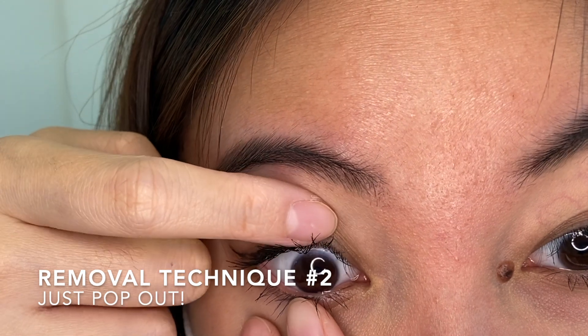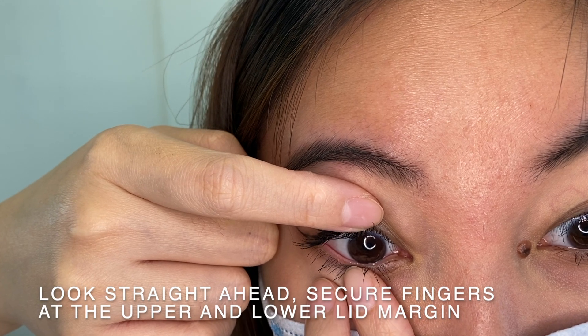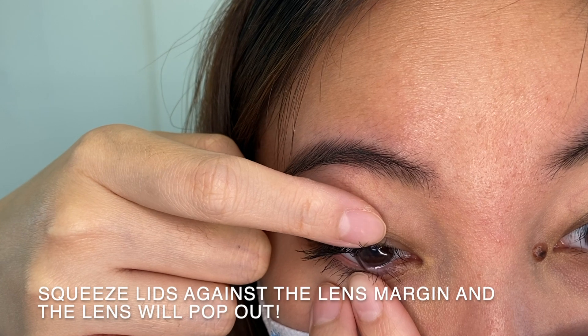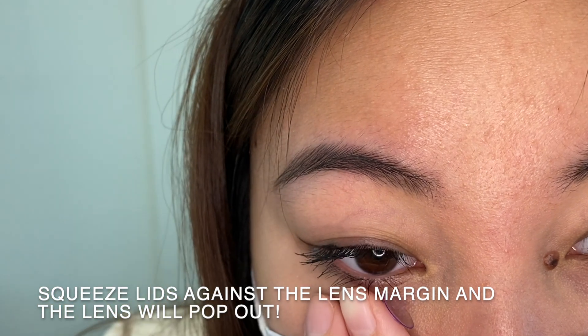Now, for the second method, it's called the popping method. Simply look at yourself in the mirror and secure the fingers at the upper lid and lower lid margin. Squeeze the lids against the lens margin and the lens will pop out.